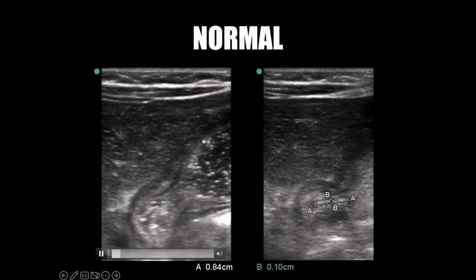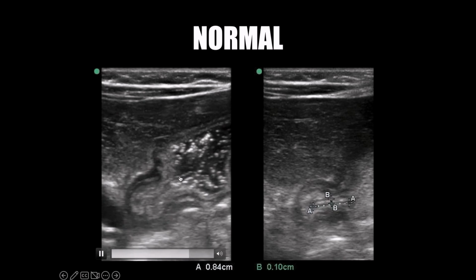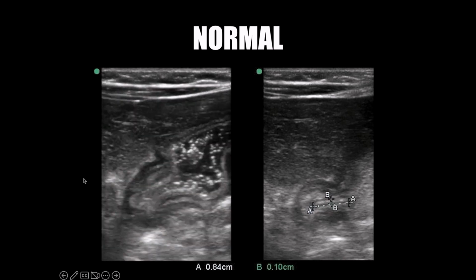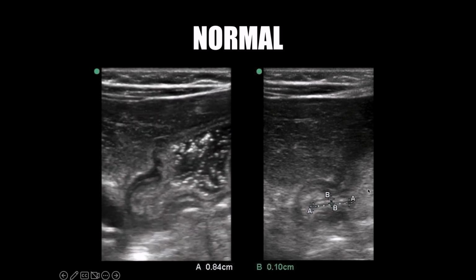Here's your gastric body here. You can see it tapering down to the pylorus here, and as you watch, you can see some of these bubbles making their way out, and they occasionally kind of slip out this channel here, but there's no big meaty chunk of muscle sitting here, and you're intermittently seeing your gallbladder popping in on the screen left. On the right, we've taken a freeze frame and attempted to make some measurements on this.